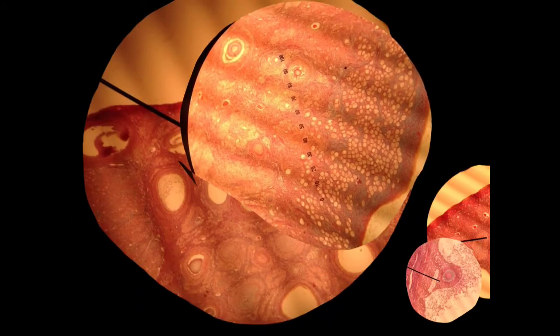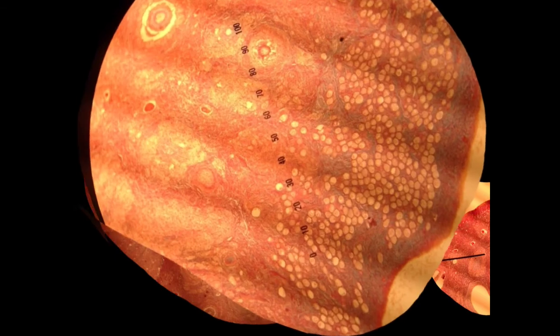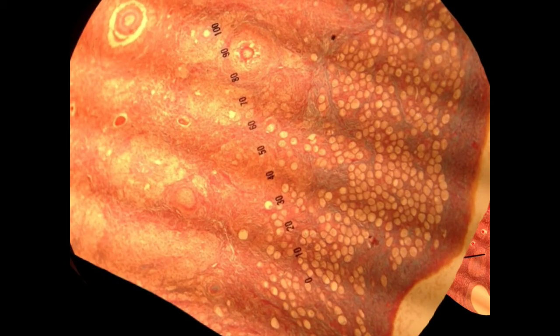And a primary follicle, let's see, I don't think we have any great pictures of a primary follicle, but I'll mention the rule really. What happens in the primary follicle is once the follicle is stimulated to develop, those squamous cells around the outside of the oocyte turn into cuboidal cells. They turn into a nice simple layer first, and then they stratify. So if you ever see an oocyte surrounded by simple cuboidal epithelium or stratified cuboidal epithelium that's still nice and circular and intact, potentially like here, where the oocyte's right in the middle, this is actually stratified cuboidal epithelium, and it's starting to break free here.